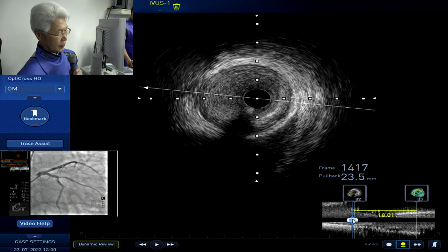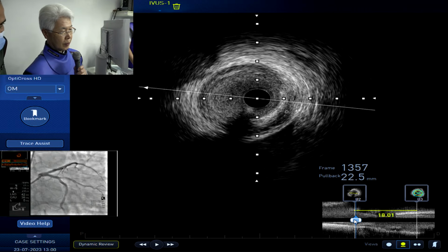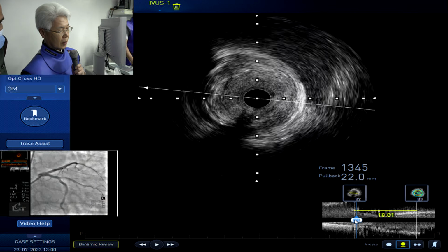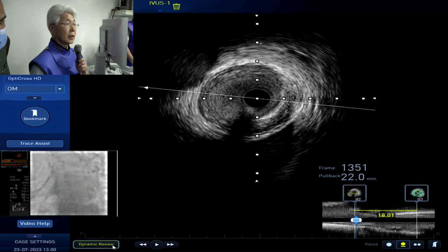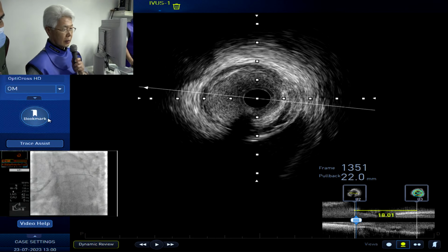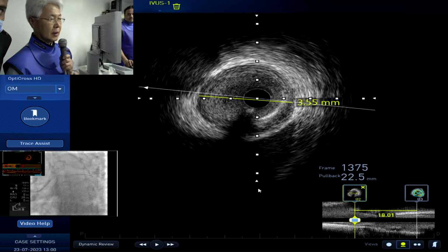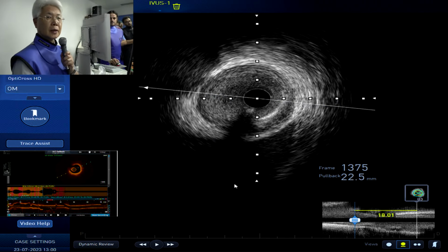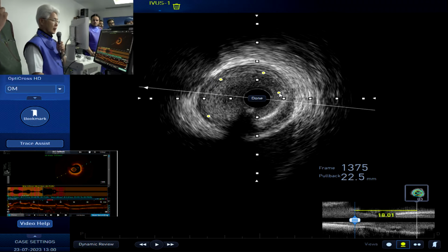It will be at least 33 then, huh? OCT has a very good assessment of it. On the OCT screen, we have good length assessment. Yeah, poor man's length assessment we will do. Go to AP caudal. Yes. Absolutely. Can you see the OCT? And let us validate it. Works better. OCT, I think there's more confidence in the poor man's length assessment. Inject.